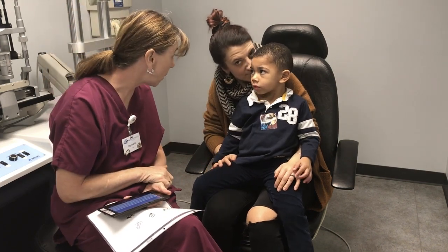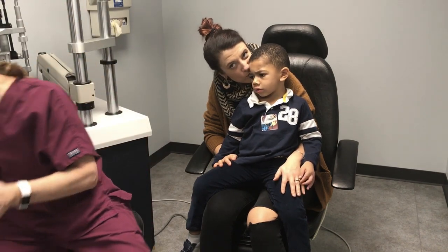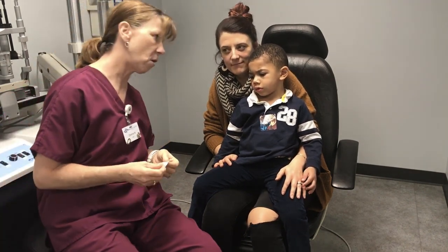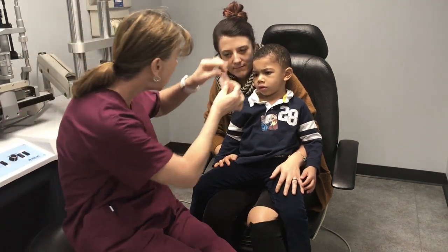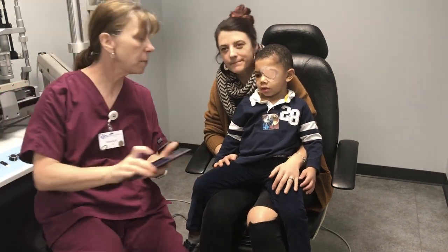Now, we're going to do a game with the pictures. We're going to play peekaboo, okay? So what we're going to do is we're going to put a peekaboo patch on our eye and look at pictures, all right? And then when we're done with it, we're going to take it off. So we're going to do it on this side right here. It may tickle your eyelashes a little bit. And there's our peekaboo patch. Now, look up at my tree.